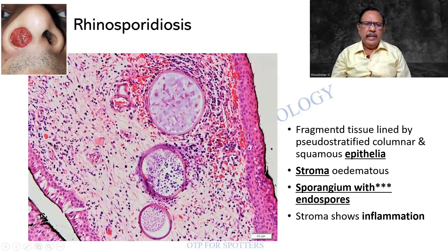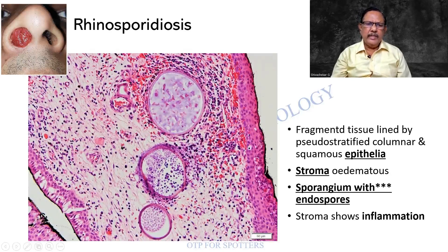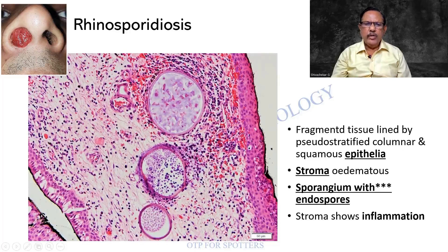Here again I am finding a lesion that is more or less similar — look at the polyp over here. It is lined by squamous epithelium as well as the columnar epithelium and goblet cells seen previously. The stroma here has a lot of edema, empty space, and inflammatory cells including lymphocytes. More importantly, there are large circular structures and some of them are having lymphocyte-like spores inside. This is called the sporangium and what is inside is called the endospore. So: sporangium with endospores, polyp lined by pseudostratified columnar or squamous epithelium. The diagnosis is rhinosporidiosis.